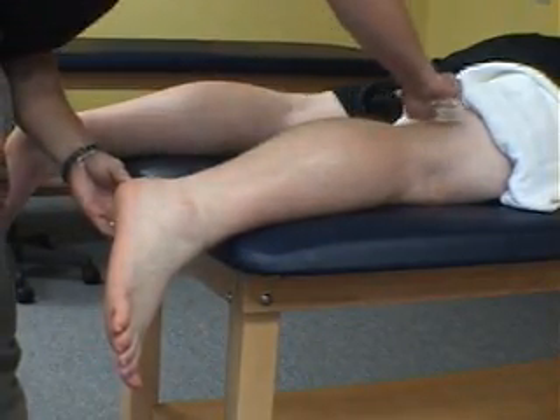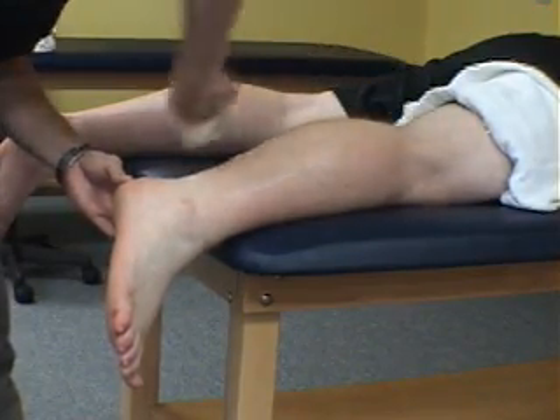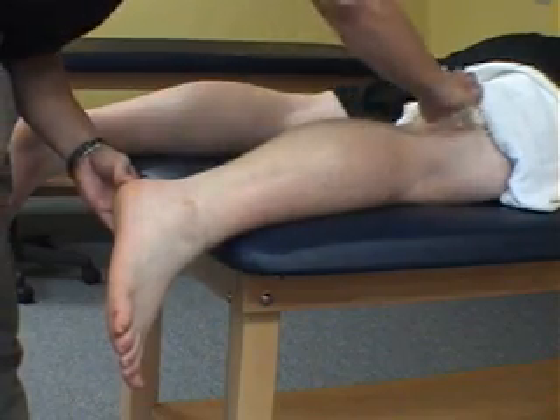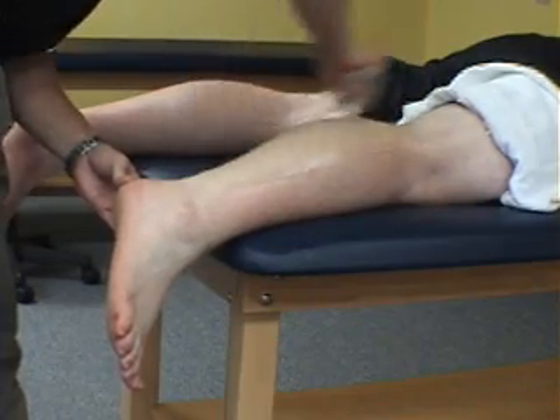We are performing a manual technique known as ASTEM on a patient with a history of a hamstring strain. It may look like we are shaving his leg, but we are not. We utilize these instruments to identify and treat areas of fibrosis, chronic inflammation, or soft tissue degeneration.